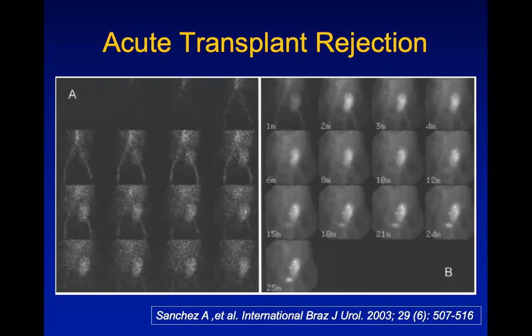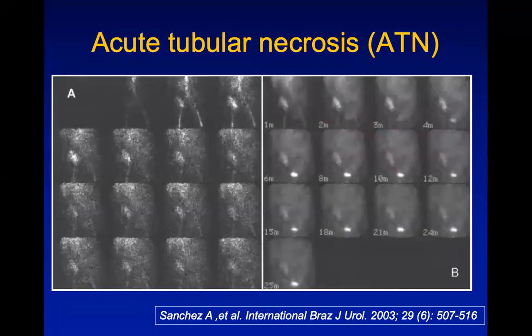Almost on a daily basis, we would get some patient of transplant or the other, acute transplant chronic rejection, whatever. But nowadays we hardly see these patients once or twice a month in our setup. So ATN, the perfusion is well maintained. As you can see, the perfusion phase, excellent perfusion.